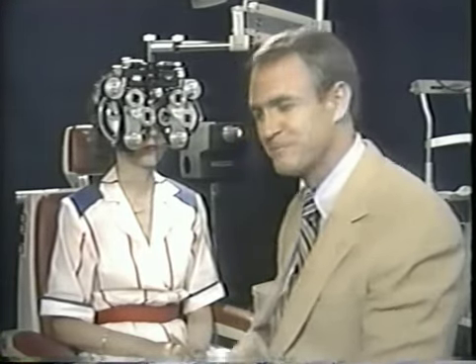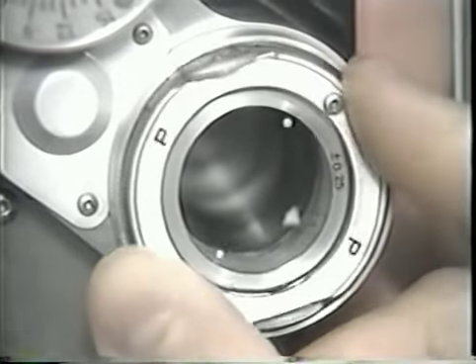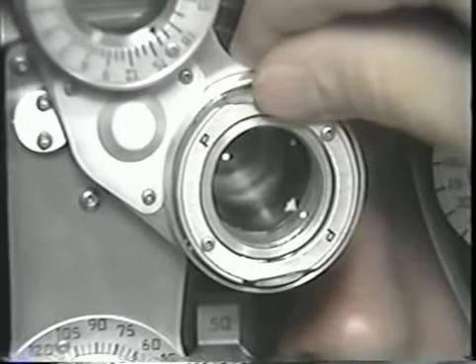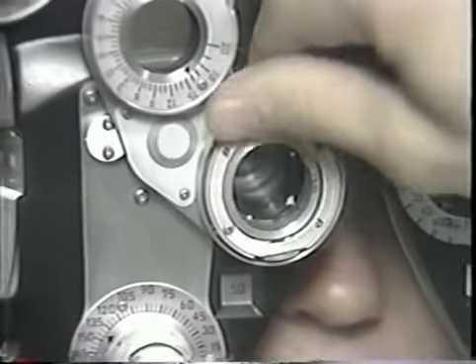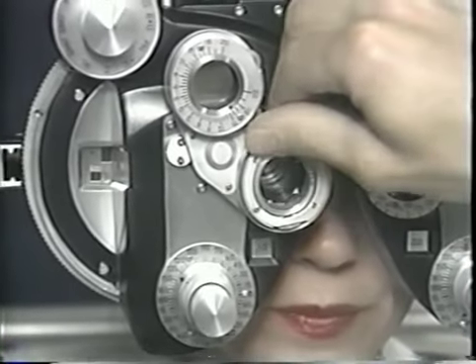Let's now refine the cylinder power. Cylinder power is refined by rotating the cross cylinder until its axes are parallel and perpendicular to the correcting cylinder axis. It clicks into position on this Reichert phoropter. Now which is better, 1 or 2? 1 or 2? 1.